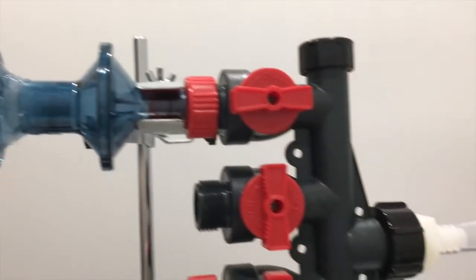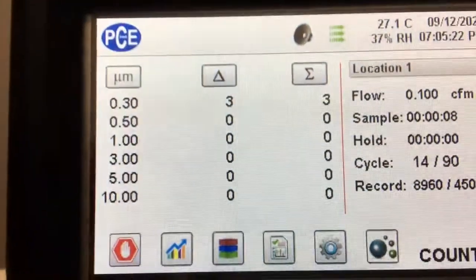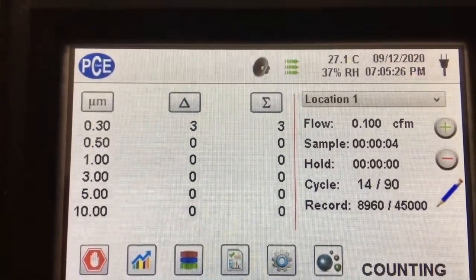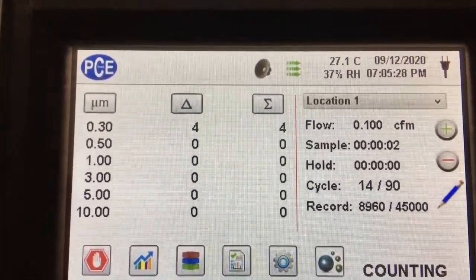Here's a video of the filter being tested, once again over 90 cycles, and we got an average of 2.58 particles in the 0.3 micron channel over 90 trials.